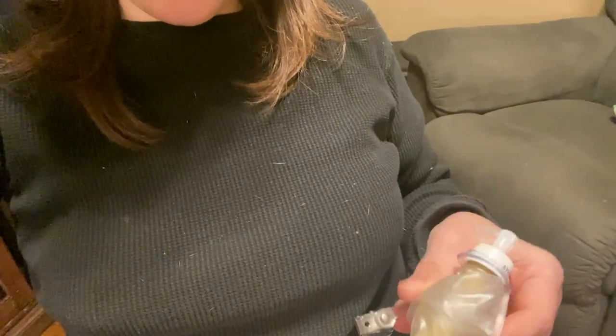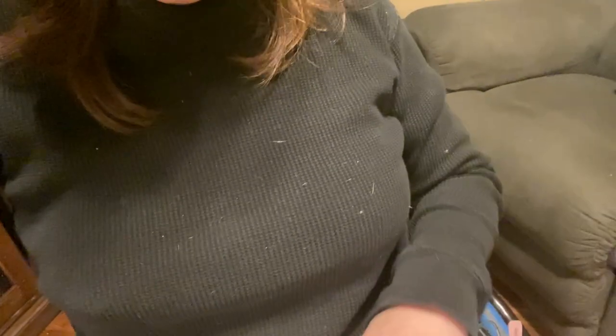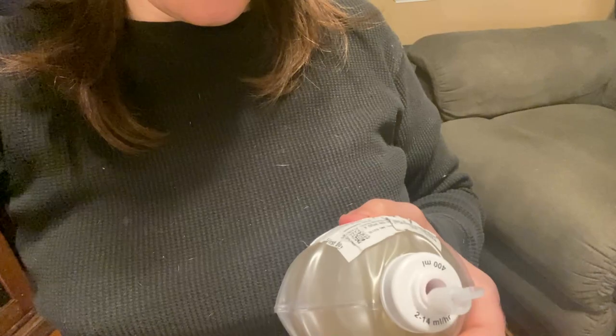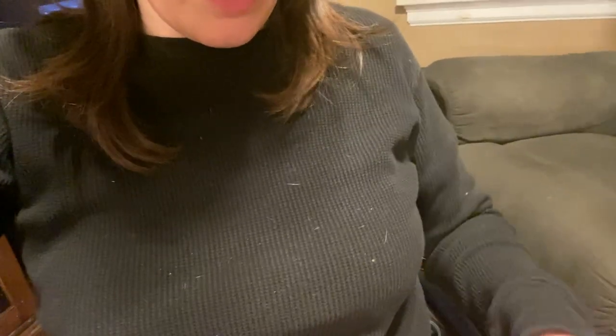Hey guys, it's Christina. As you can see from my environment, I am home — I got discharged from the hospital. Since then, my pain has been increasing in my residual limb, and I think I know why. I got two of these — this is the bigger one and the smaller one. You can see this one is emptying out, but this one honestly looks about the same as when I got it. It seems like it's not draining the lidocaine into my residual limb.